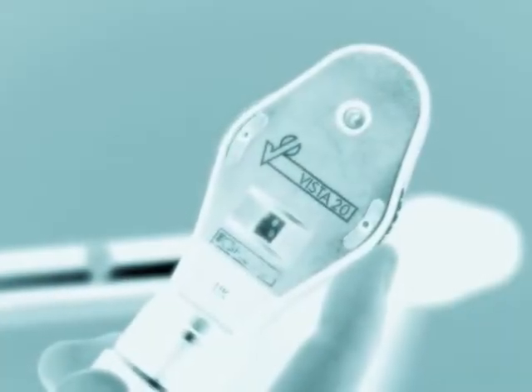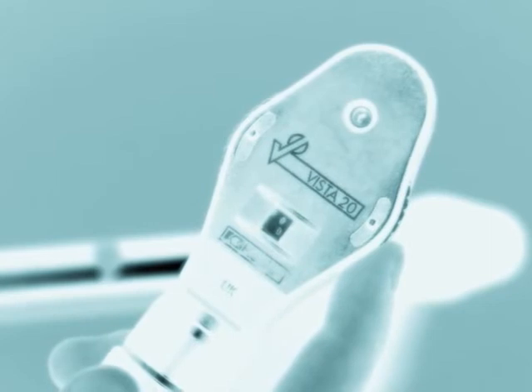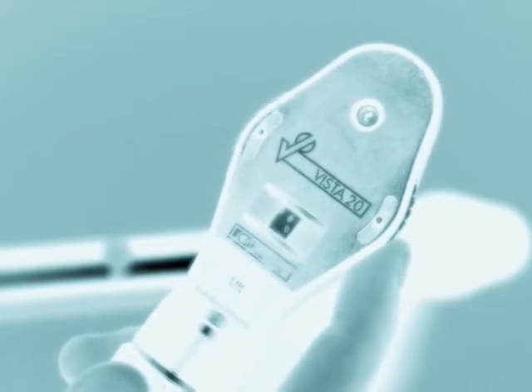Using the direct ophthalmoscope can be challenging at first. However, with practice, it can become an essential diagnostic tool for ophthalmologists, physicians, and general practitioners.